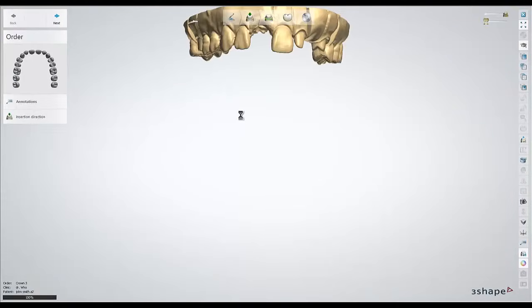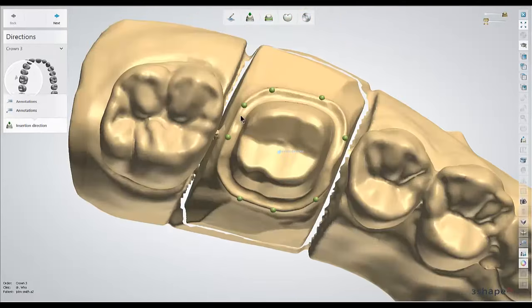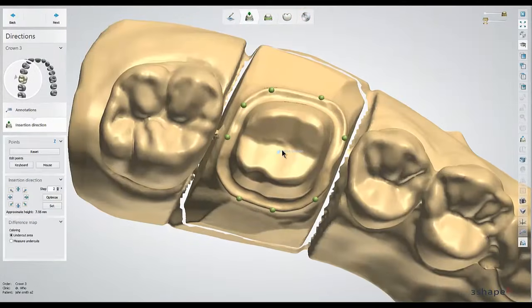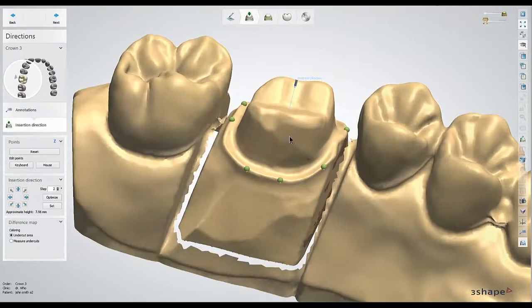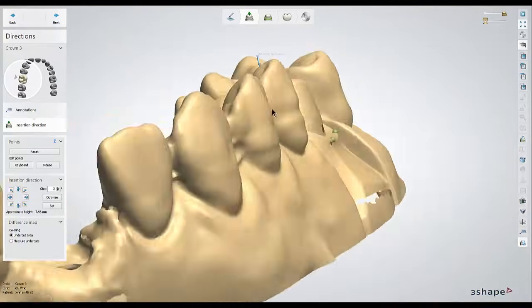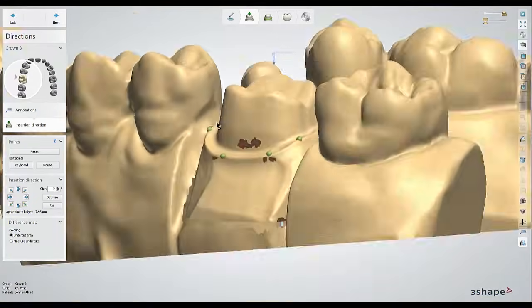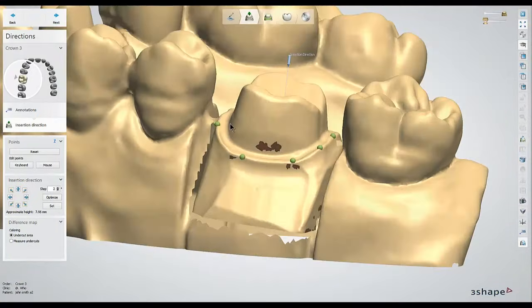When you first open up Dental Designer, it'll drop you off at the insertion direction step. It always comes up with an insertion direction by default, and it'll also highlight any areas that happen to be undercut in these red highlights.